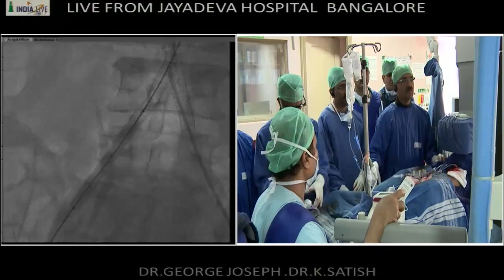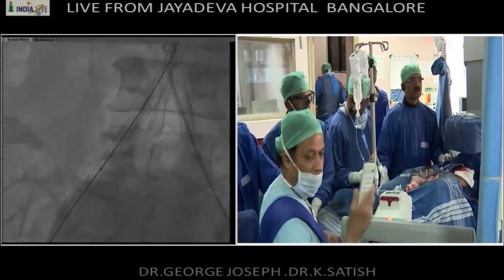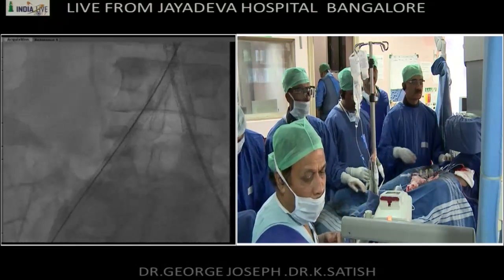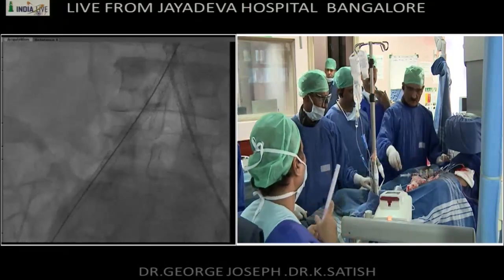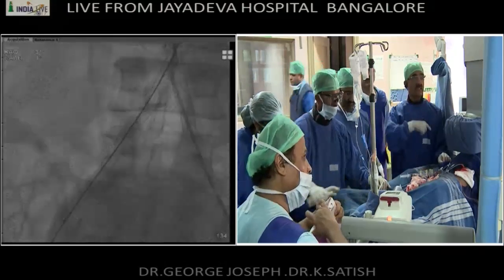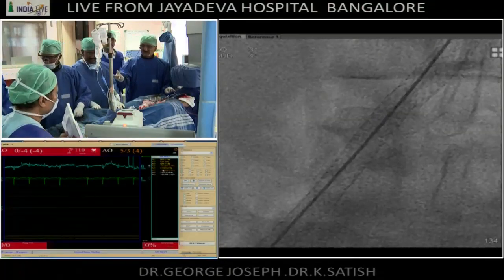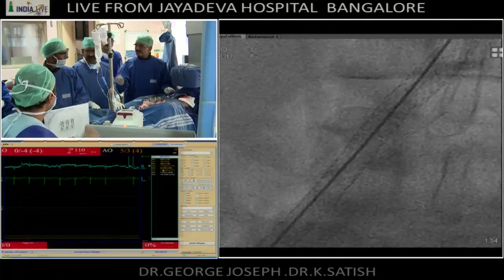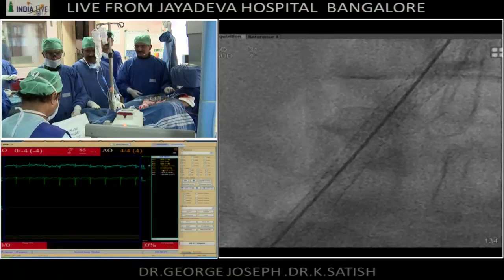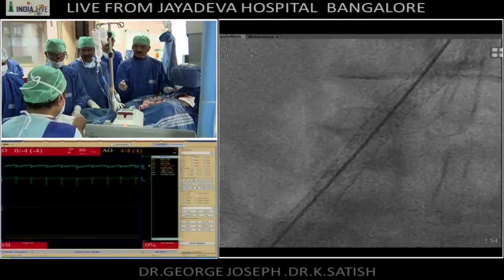Now we'll go with the 8 balloon. Are you going to use the same stent balloon you deployed the stent with again? No, I think they've got another 8 millimeter balloon. Okay. Just show us what it is.